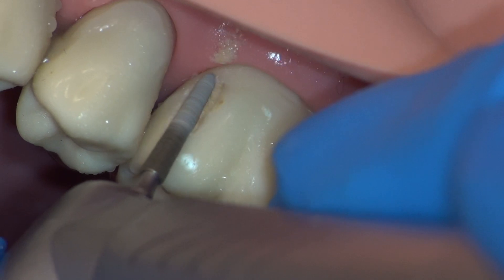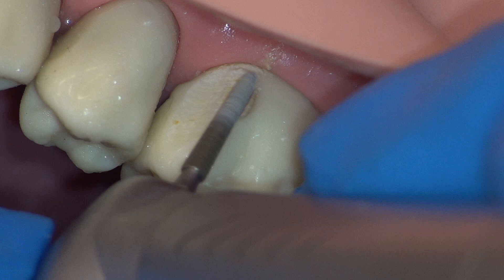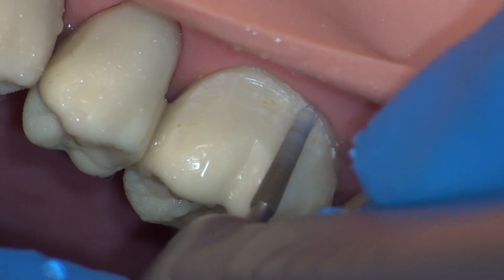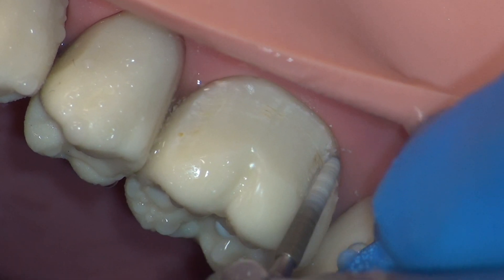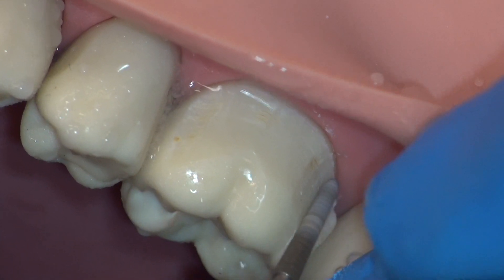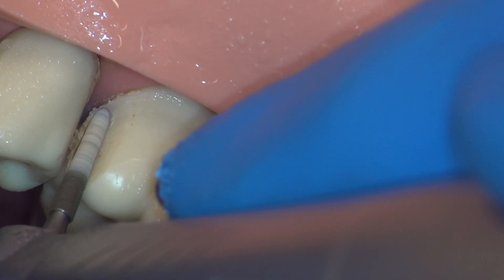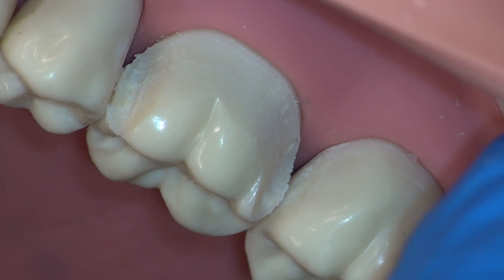We begin our reduction from mesial to distal using a systematic approach. Our goal is to set the finish line as close to our desired location as possible. This will minimize the amount of passes we need to achieve an ideal prep and save time. For a chamfer burr, keep your eye focused on the tip of the burr. This will help you to avoid the creation of a J margin and to ensure the proper depth of reduction — 50% of the width of the burr. Change the direction of rotation to clockwise to extend the finish line towards the mesial interproximal area. Ensure that this buccal reduction step is completed before moving to the next step.